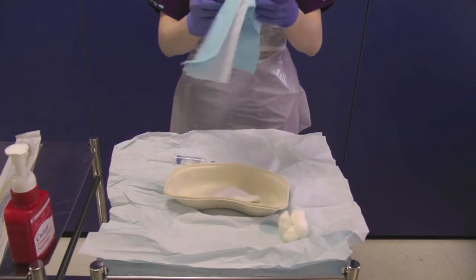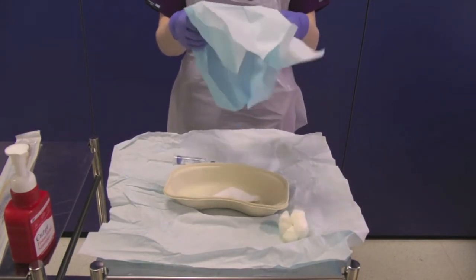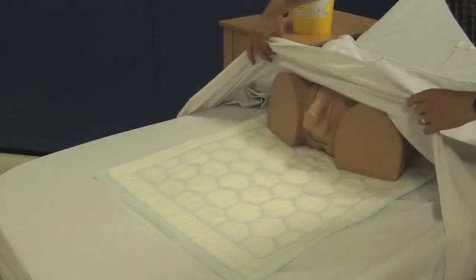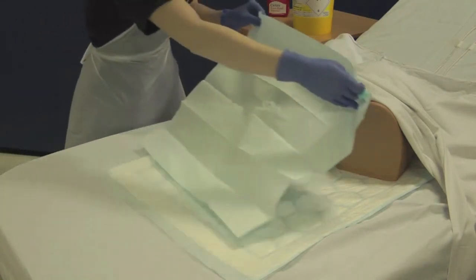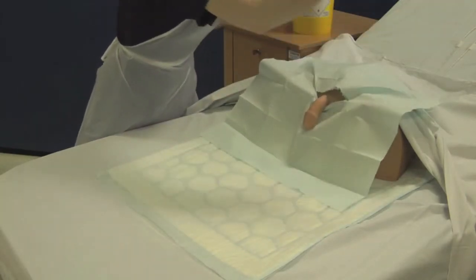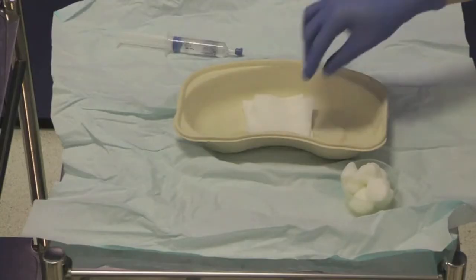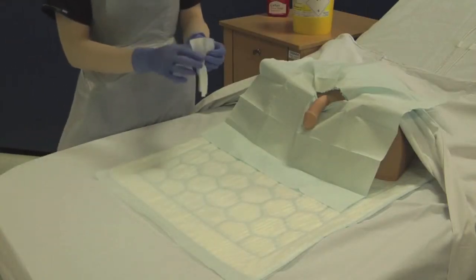Open out the sterile drape and tear a hole in the centre of it. Ask your assistant to expose the patient. Note the presence of the Inco pad to prevent soiling of the bed sheets. Place the sterile drape over the penis. Use a sterile gauze to create a sling.